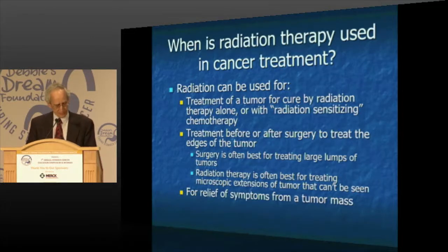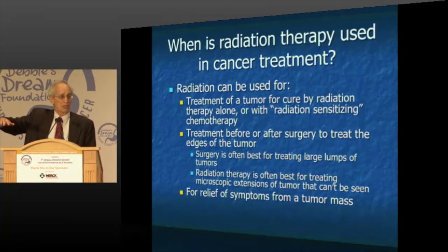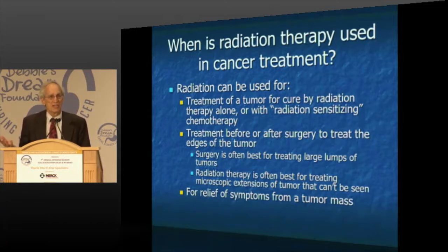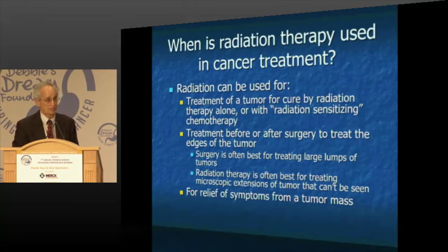And actually, let me just go back. And so when a patient comes in to be treated, they basically will lie down on a couch. That machine will be aimed at them in a way that I'll describe in a few minutes. And the treatment may take 1 or 2 minutes, depends on the details of what's happening. And you get up, and it's no different immediately after treatment as what you might feel after a diagnostic X-ray.